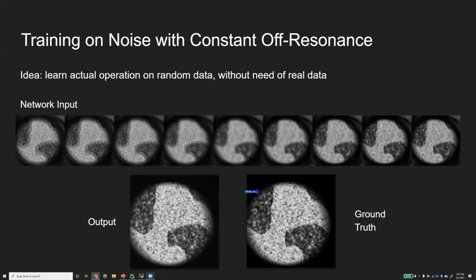Then we said, why train with only brain data? Maybe we can be a bit more general. Let's try to train with only noise. We can generate random maps of noise by generating random K-space and masking it with an exponential. Going back to the image domain, you get an image with different frequencies, some super noisy, some less noisy, basically adding randomness everywhere to have random data.